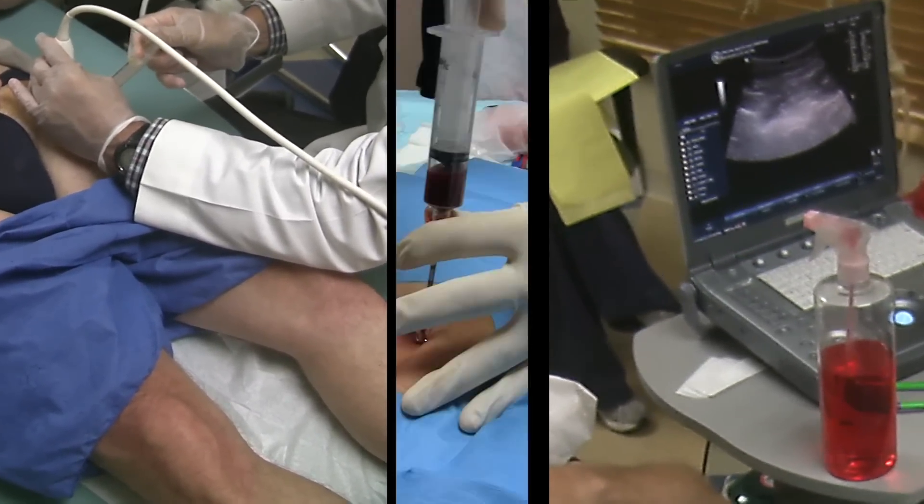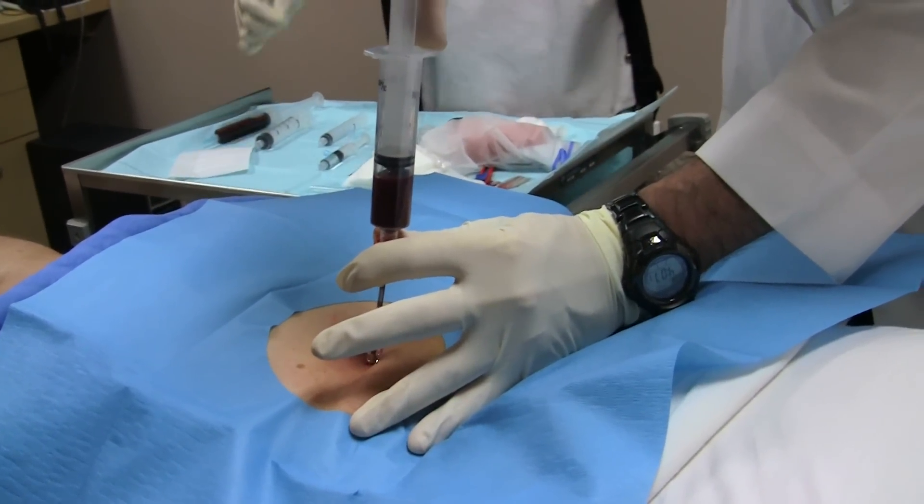You will see the harvesting process for stem cells. This process is minimally invasive and allows the patient to soon return to regular activities.